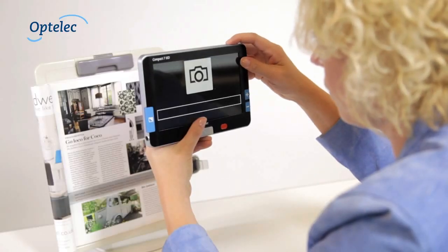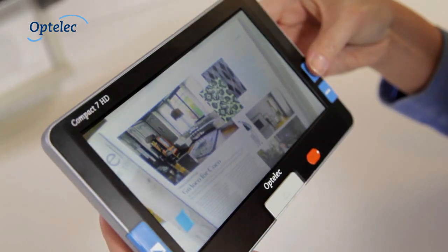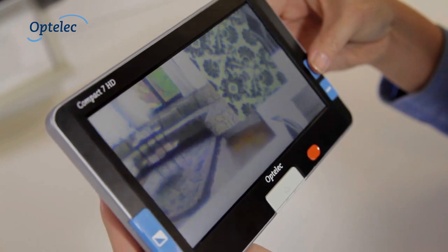You can also use the Compact 7 HD to take photos. Press the photo button to take a picture. You can view the photo you have taken at your convenience.